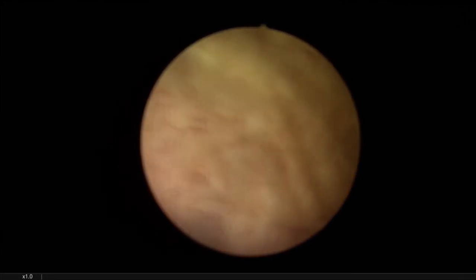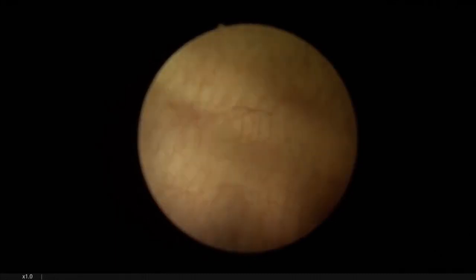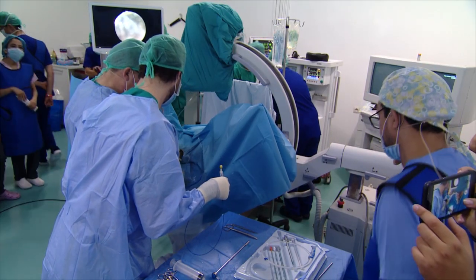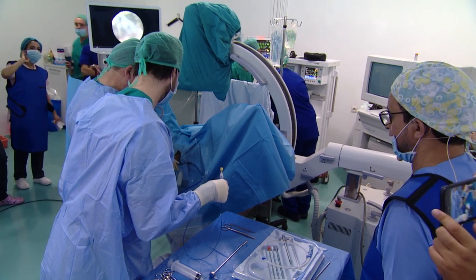Okay. Now we can empty the bladder. In endourology, of course, I know that you know this, but I'm expanding it. It is better to have an empty bladder always.